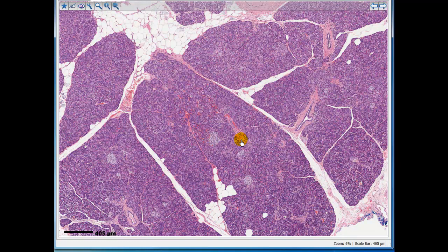So that's the way organs are built up, and your goal in the course is to learn to read a histological specimen in a similar way that I have read, going from low to higher magnification, appreciating the unique pattern of this pancreas and how it will contrast to the unique histological pattern of these four basic tissues and their densities compared, for example, to the kidney or to the GI tract, the duodenum, stomach, and so forth. So I hope that gives you a little bit of insight into what you're going to learn and your ability.